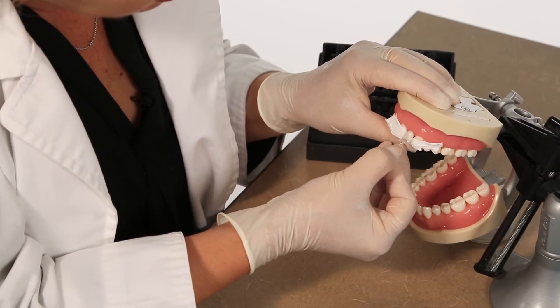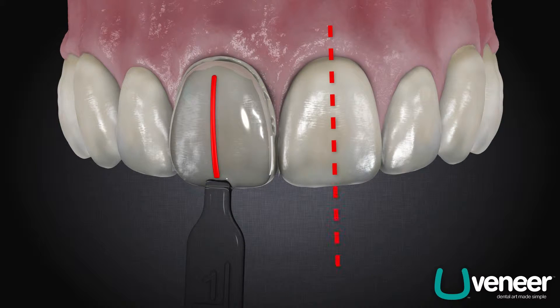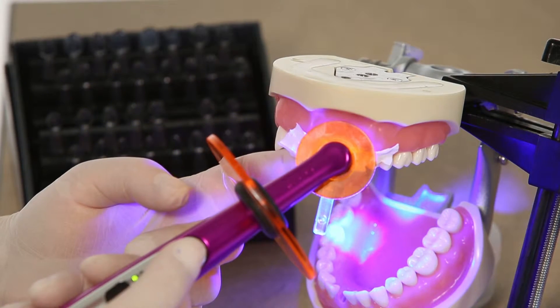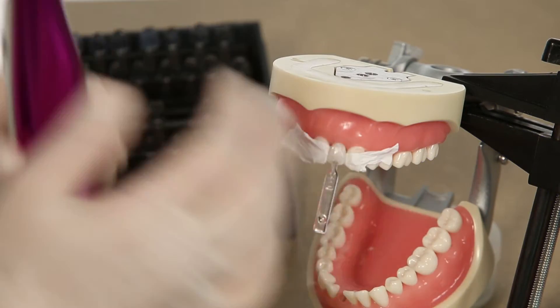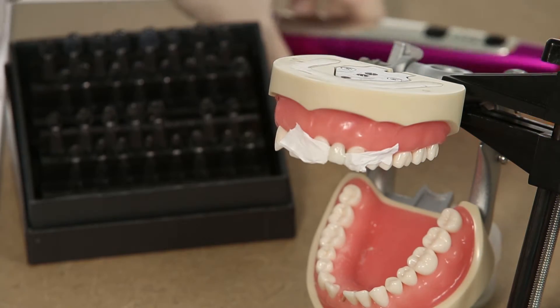Then, making sure the center line on the template is parallel with the center line on the face, light cure for 40 seconds. The template should easily be removed from the cured composite.